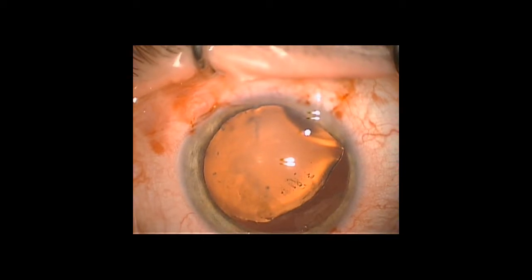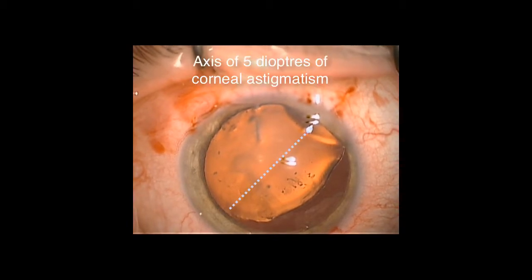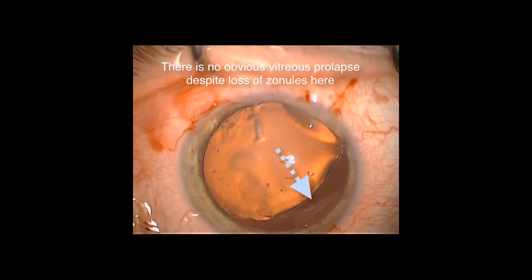Faced with a difficult cataract extraction, such as in this case, it is important to do a lot of planning preoperatively. Corneal topography demonstrates that there is 5 diopters of oblique astigmatism. This is something which one will want to address during the surgery if possible.